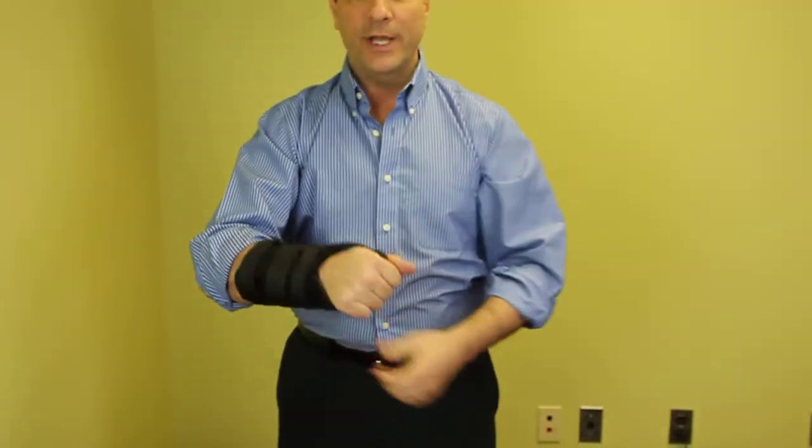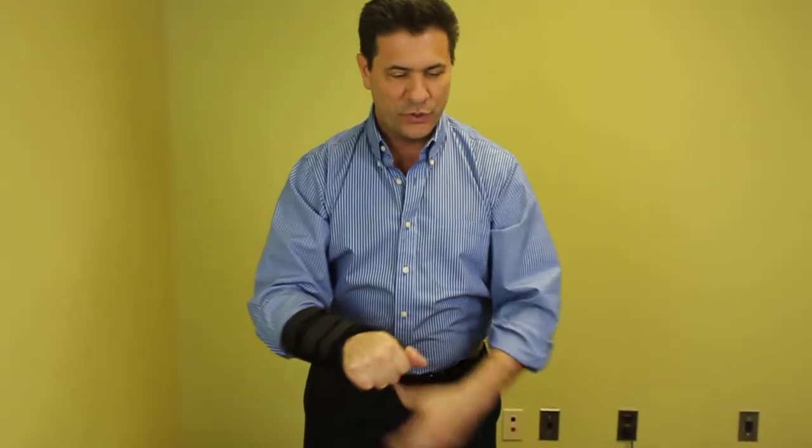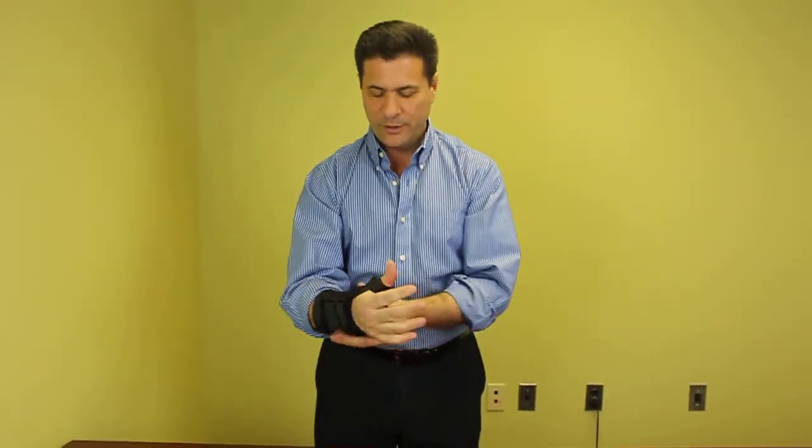This is very lightweight and very comfortable. It's used for many different problems a patient might have — if they have arthritis in their wrist or in their thumb, or if they have a sprain. There are various ICD-9 codes that a patient can use for this particular device. This is PDAC code L3807.